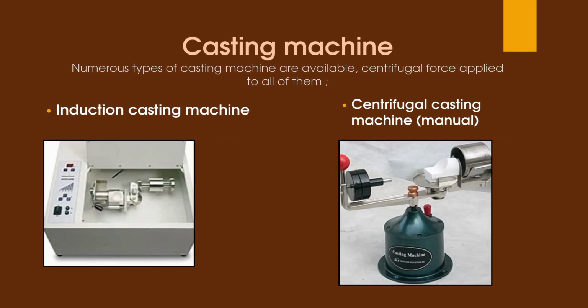Casting machine. There are numerous types of casting machines available. Centrifugal force is applied in all of them, of which I am telling you about 2. Number 1 is an induction casting machine, and number 2 is a centrifugal casting machine.